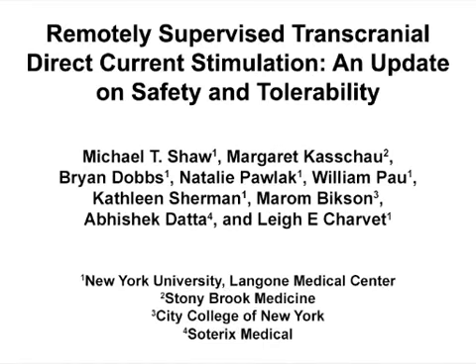The overall goal of this procedure is to demonstrate a repeatable and effective methodology for administering remotely supervised transcranial direct current stimulation. This method can help answer key questions in the field of neuromodulation, such as extended dosing. The main advantage of this technique is that tDCS can be performed from a patient's home or a satellite site with real-time supervision by study personnel.